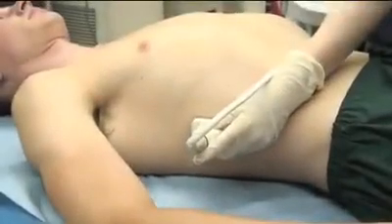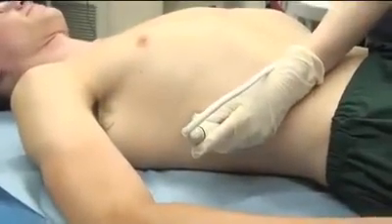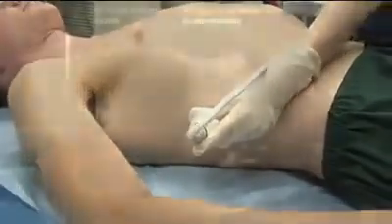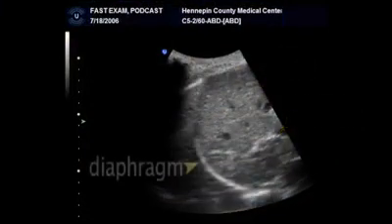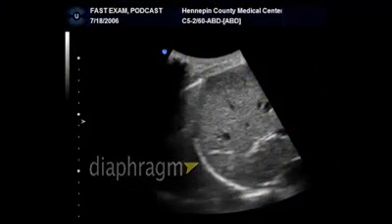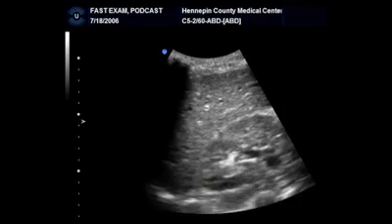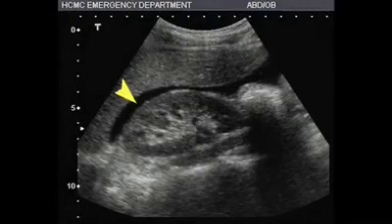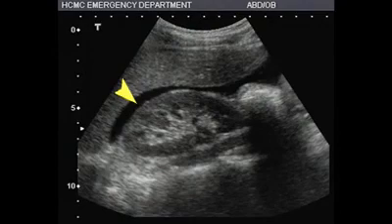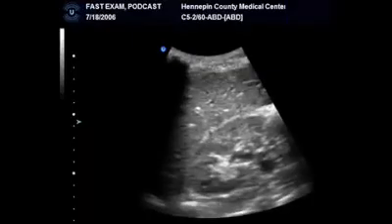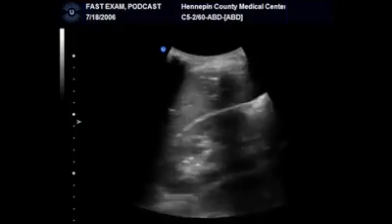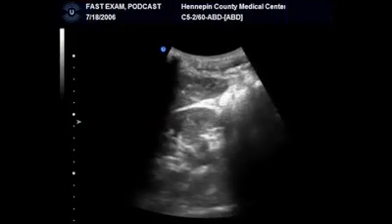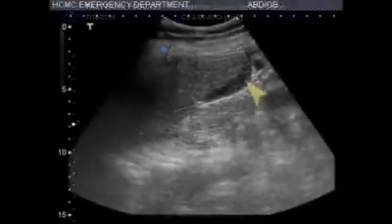The probe is placed in the mid-axillary line at about the 7th to 11th rib interspace. This view will demonstrate the liver, kidney, and right diaphragm. It allows for the evaluation of the potential space between the liver and kidney, called Morrison's pouch. An anechoic, or black, stripe between the liver and kidney in Morrison's pouch indicates free fluid, usually blood, in the intraperitoneal space. By sliding the probe towards the patient's feet, you can visualize the lower tip of the liver, where free fluid also tends to accumulate.